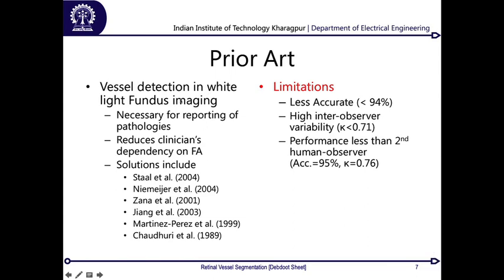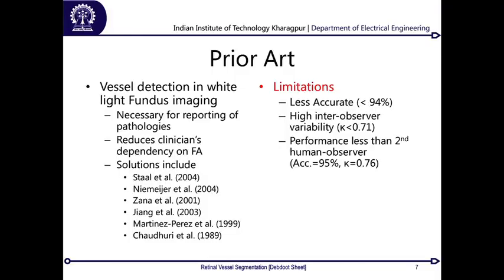Now, till now, since we haven't seen that many images, you would often come to this contemplation: maybe it's not so complicated that you would have to put a computational technique over here. But I would come to those exact problems as to why we have a computational technique, because by bare eyes we would often fail to find those vessels. So once we go to those images, I would be showing you pinpointed spots where that particular ambiguity comes.